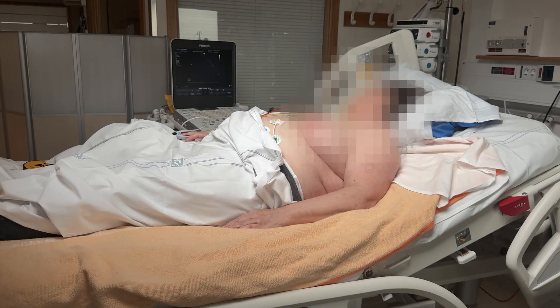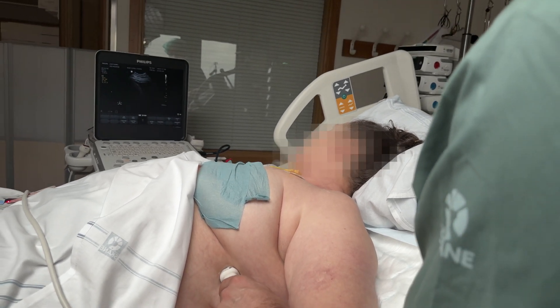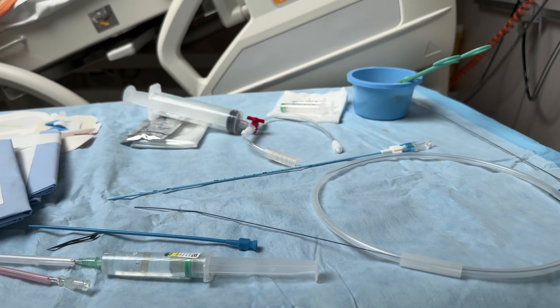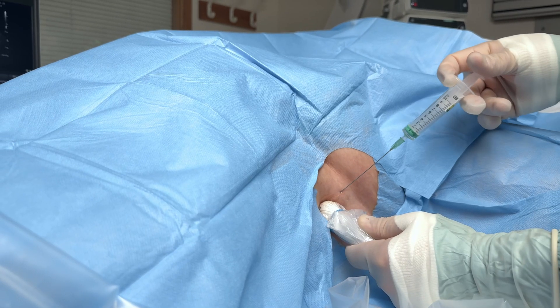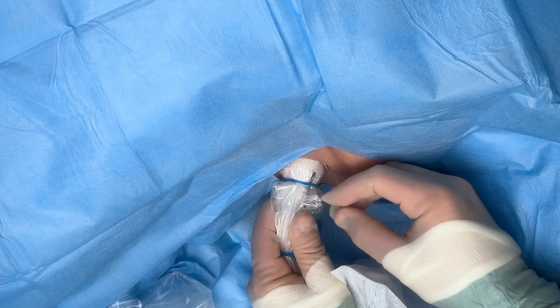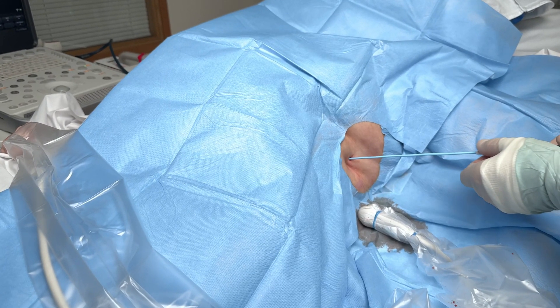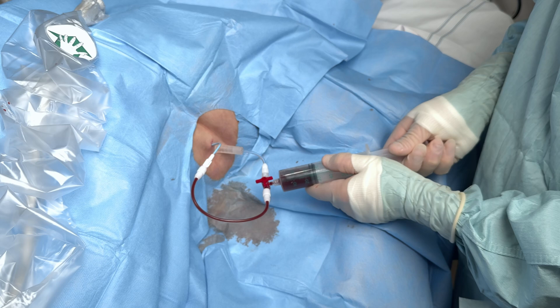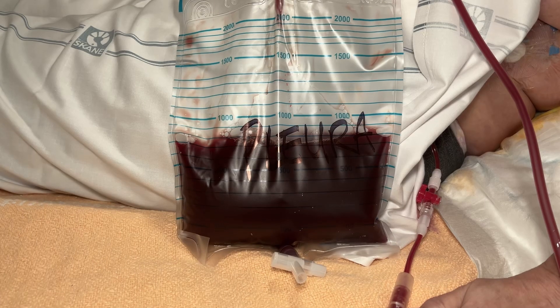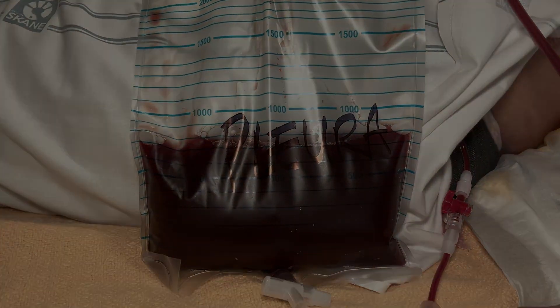In our opinion, real-time ultrasound guidance is mandatory for all pigtail drains. The widely used pre-scan and then blind puncture is not good enough. The Seldinger approach offers many advantages, the most important of which is safety. A word of caution, though — we make this look easy, but there is definitely a learning curve. We recommend expert supervision if you're starting out, or drop us a line if you want us to come to your hospital and hold a workshop. Check out our other material at interanist.org.